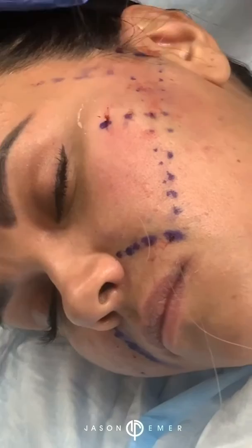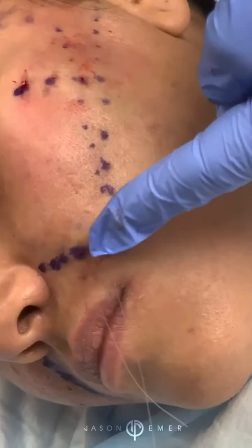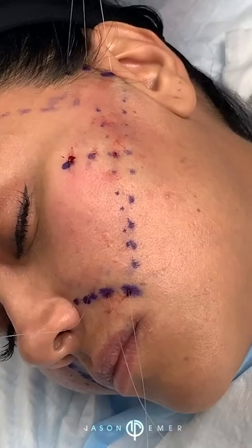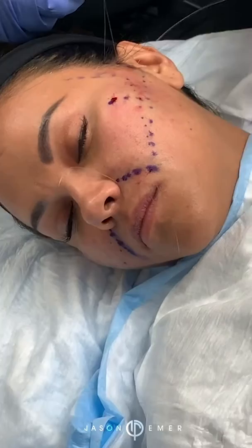You can see we're going all the way up and vectoring these — they go right under there, nice and safe. We can literally pull her folds all the way up, and if I grab all the threads, look how much of her face I can actually lift. Grab here, grab there — once we tighten, look at that. So the goal is that's what's going to happen over time.